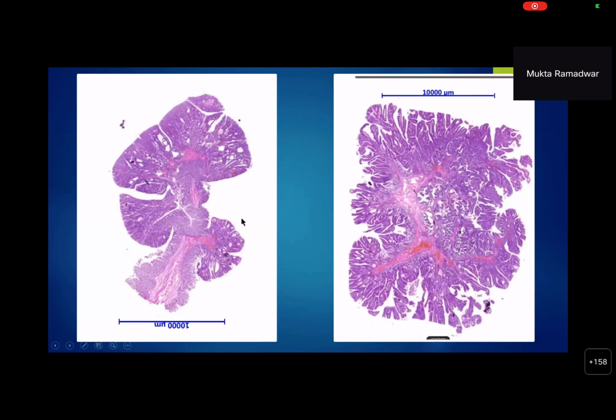Yes. Right. So as Shreyans correctly said, we have a polyp here, and it is pedunculated. That's very important. And why do you say it is pedunculated? Because we can actually see this stalk, and this polyp begins here. After the stalk ends, the polyp begins. At this power, Shreyans, can you say what kind of polyp this could be?